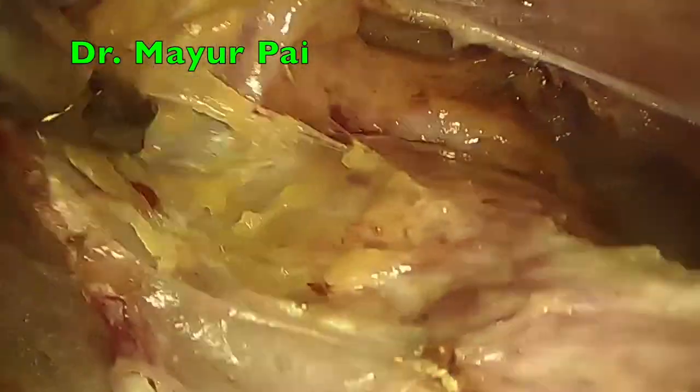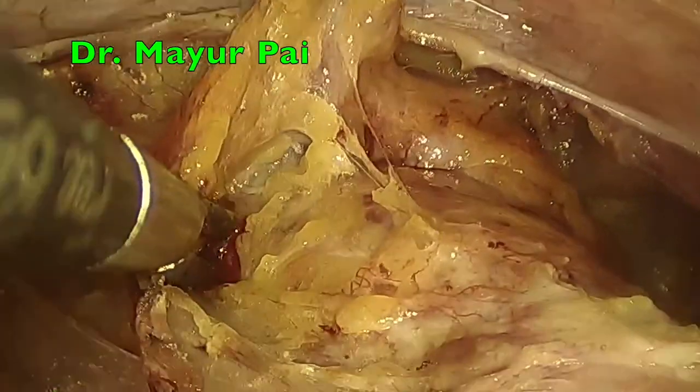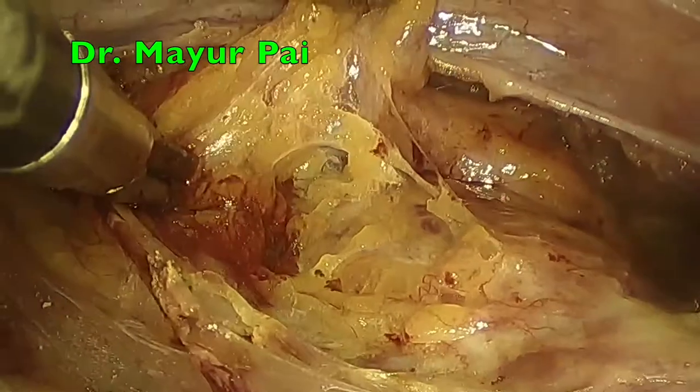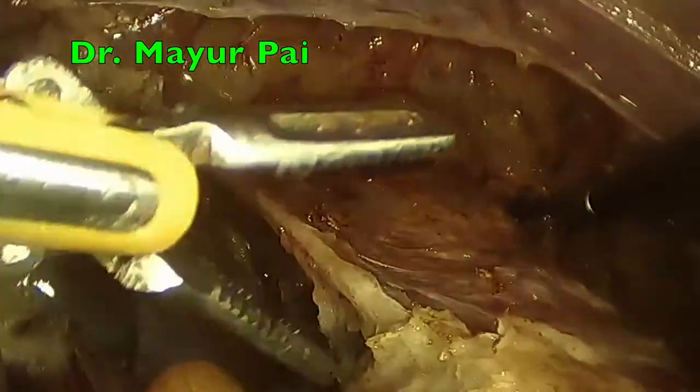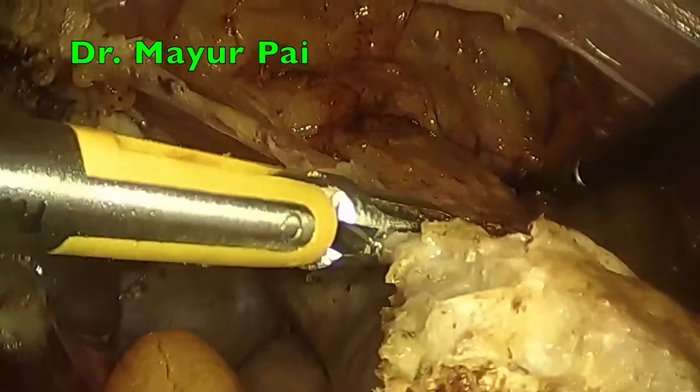This part of the dissection is called the bladder pillar dissection. It always contains certain venous structures, and a little bit of bleeding while pulling on that structure is common.